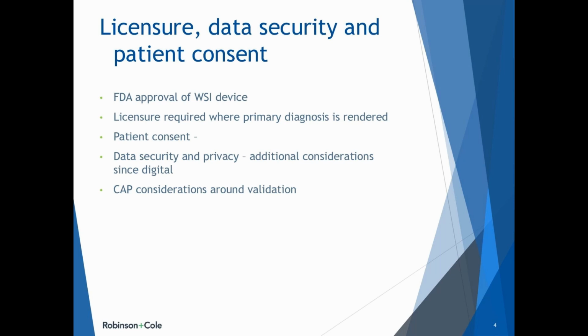The pathologists do still have to be licensed in the same state where primary diagnosis is rendered. There are various state licensure laws. There's also the Interstate Medical Licensure Compact, but that's an important part as we think about this telehealth type model: that everyone is appropriately licensed, not only in the lab under CLIA and things of that nature, but also from a professional standpoint, and that you're following all the state requirements too.